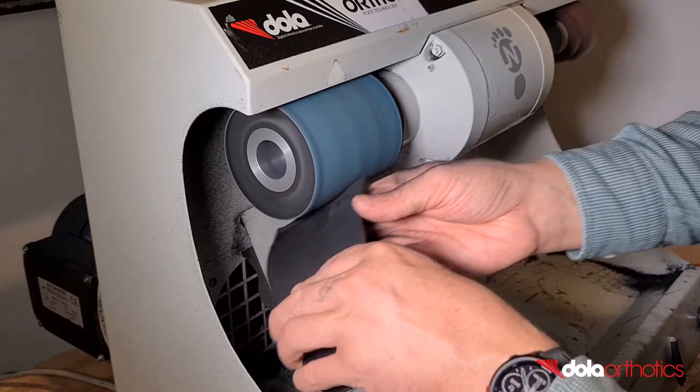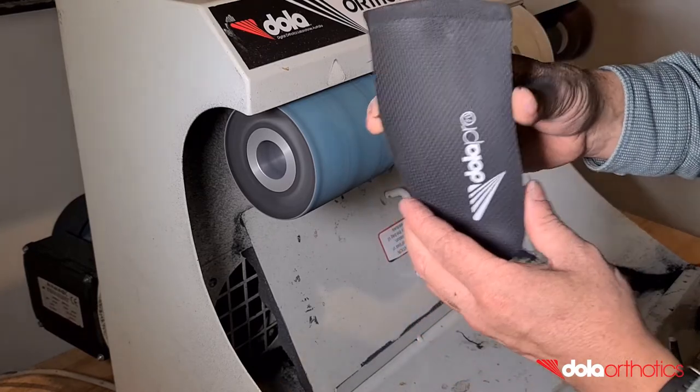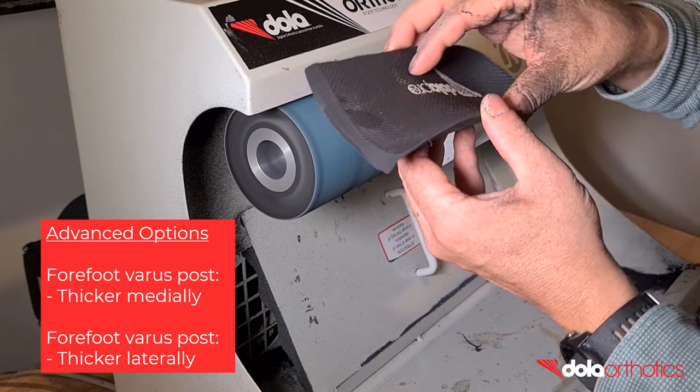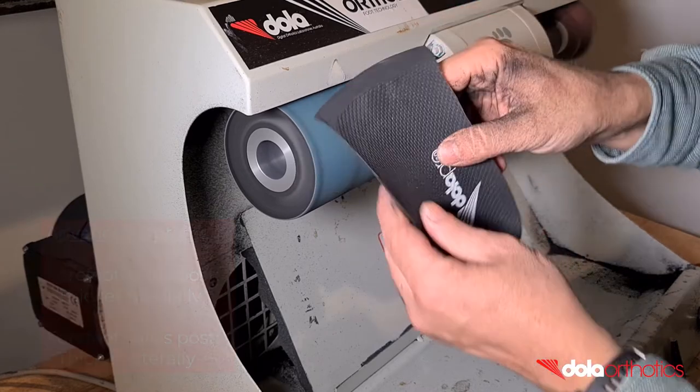Alternative advanced modifications include angling the anterior edge taper in the frontal plane to create an intrinsic forefoot varus or valgus post. A forefoot varus post will be thicker medially and taper laterally. A forefoot valgus post will be thicker laterally and taper medially.